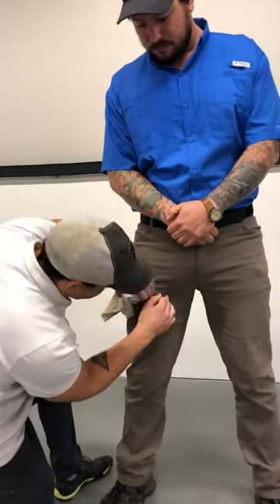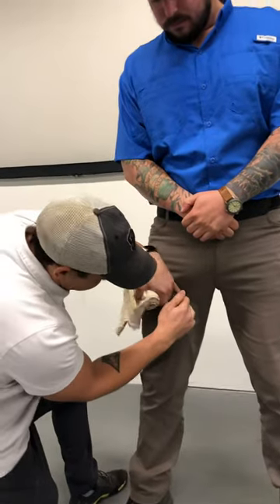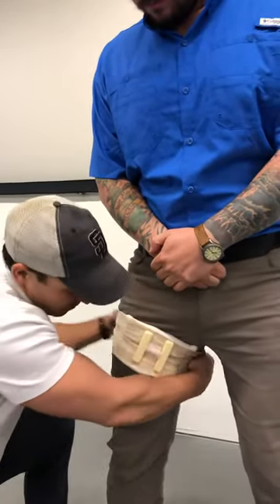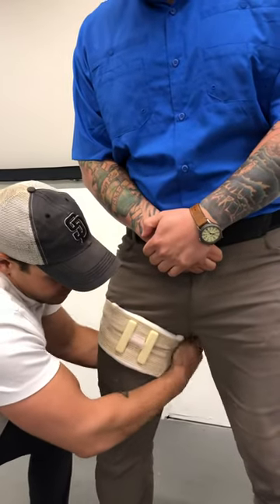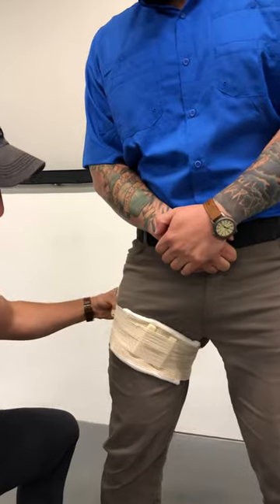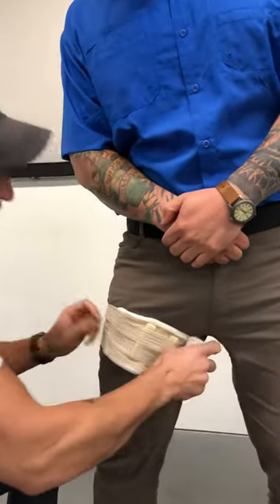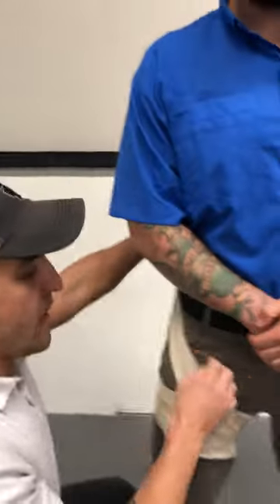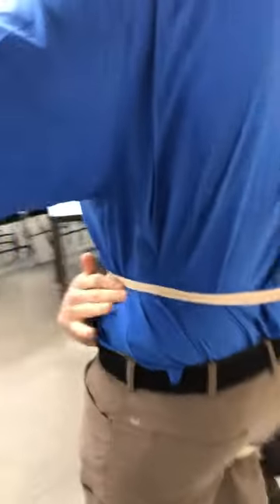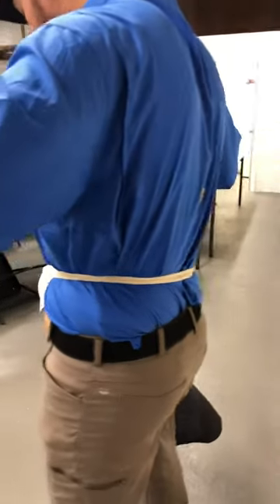We're going to take our combat gauze, pack it against the artery, against the bone itself, and toward the heart, then wrap right here — wrapping around the leg, keeping that in place. After that first wrap, we're going to wrap around the actual patient's body, going above that iliac crest right here, then coming back down.